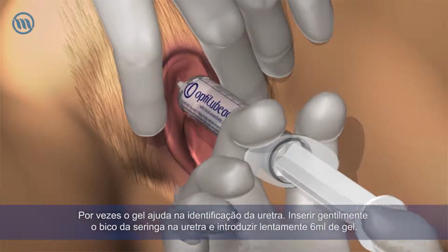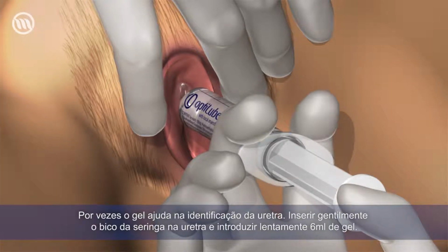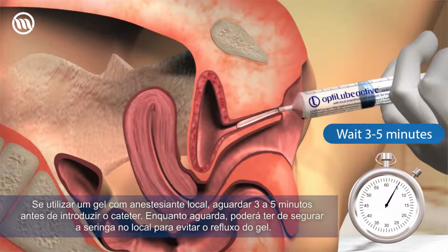Take hold of the syringe of lubricating gel and apply a little gel to the meatal opening. The gel sometimes aids identification of the urethra. Gently insert the nozzle of the syringe into the urethra and slowly instill the 6 ml of gel. If using a gel with local anaesthetic, wait for 3 to 5 minutes before inserting the catheter. You may have to hold the syringe in place to prevent the gel from leaking out while you wait.